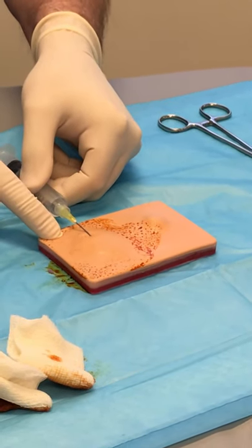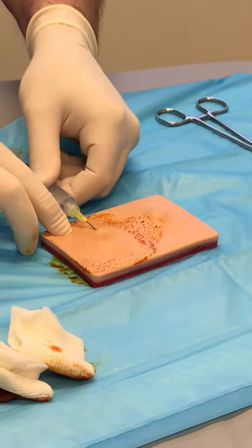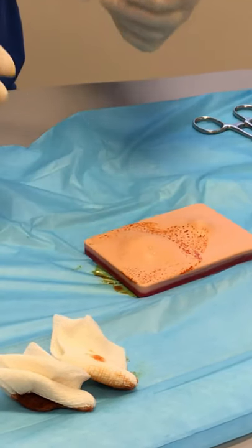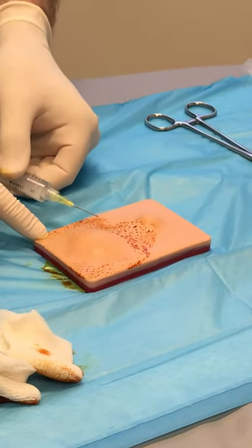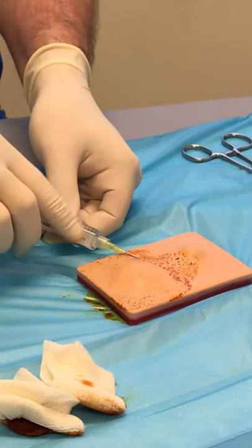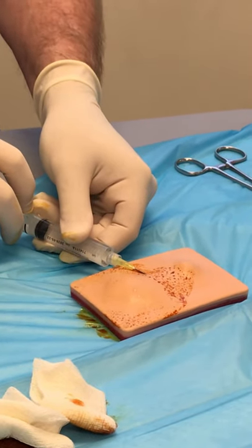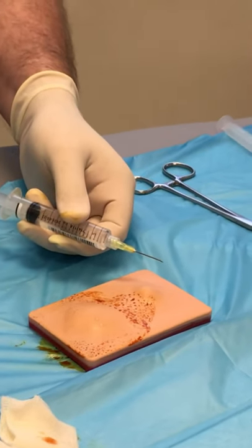To numb this thing up — these don't get super numb unfortunately. I'm going to figure out where I'm going to cut it — horizontally across the short width. I want to numb the track I intend to incise through. I'll advance the needle from the numb area to the non-numb area and keep advancing it across. That usually won't get it too numb. The other technique is a field block — basically go around the outside, about a centimeter from the edge of the wound, numbing all the way around. You know the anesthetic is going in the right place when the skin puffs up into a wheal.